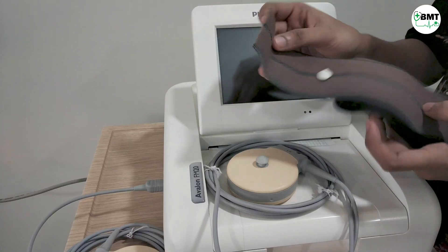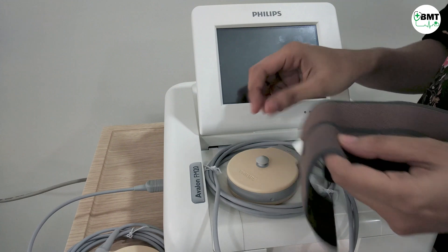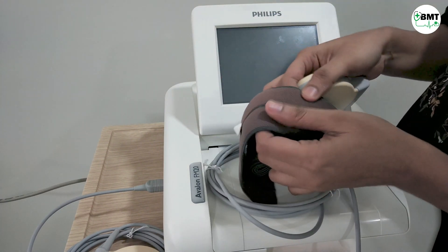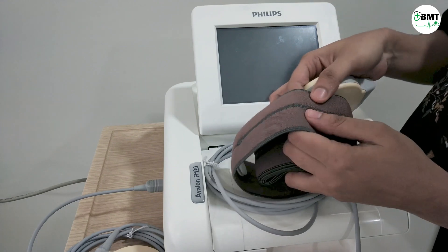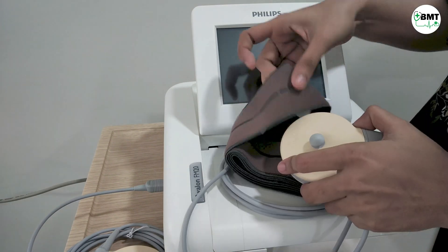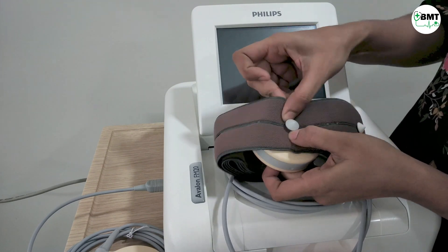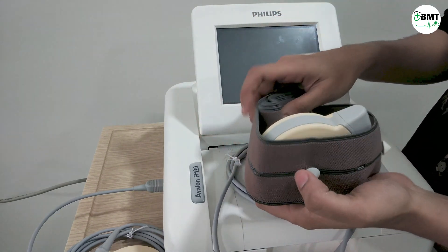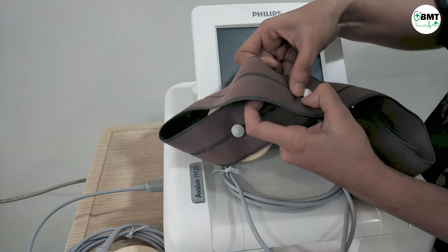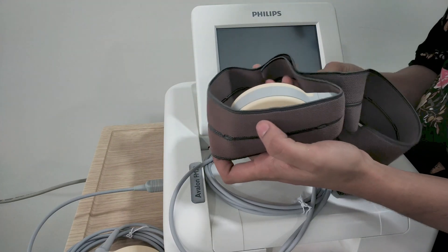This is the probe which needs to be connected to the patient. To connect the probe with the belt: take the belt — you can see there are holes in it — insert the probe into it, and then wrap the belt around the patient's belly.